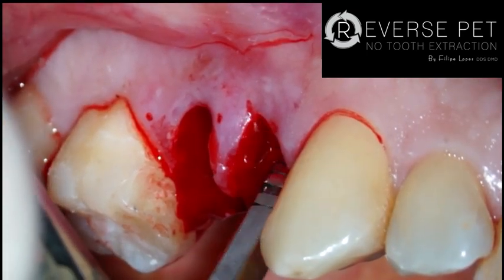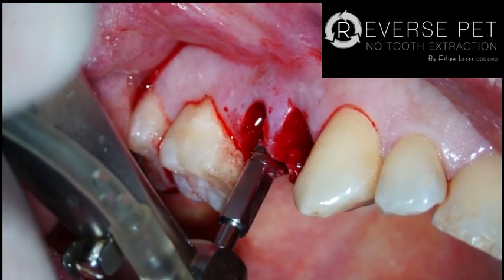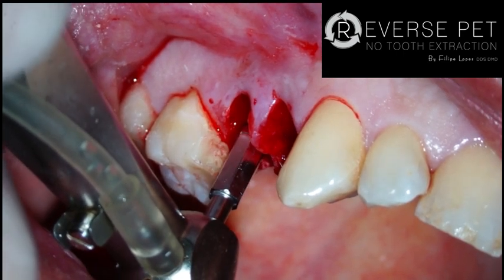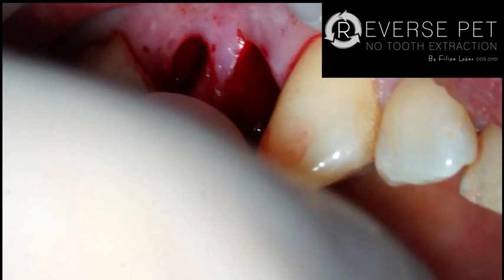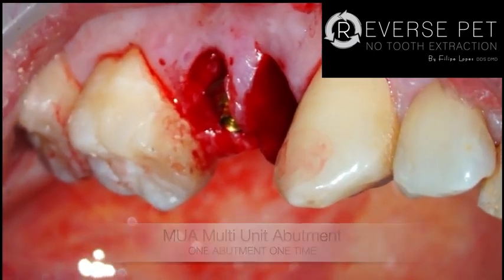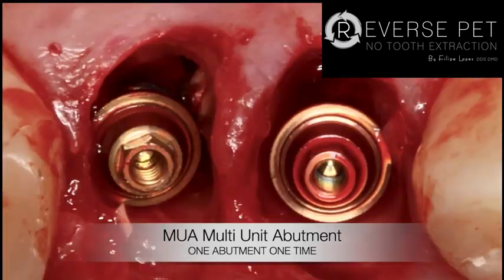I'm placing the implants. Okay, as you can see, the implants are placed well and leveled or just a little below bone level, bone and shield level. Okay, so they are placed really deep, I would say 4 to 5 millimeters subgingival. Now I am extending my implants with, in this case, multi-unit abutments. So to get the advantages of one abutment one time. So I extend my implant with the MUA multi-unit abutment.